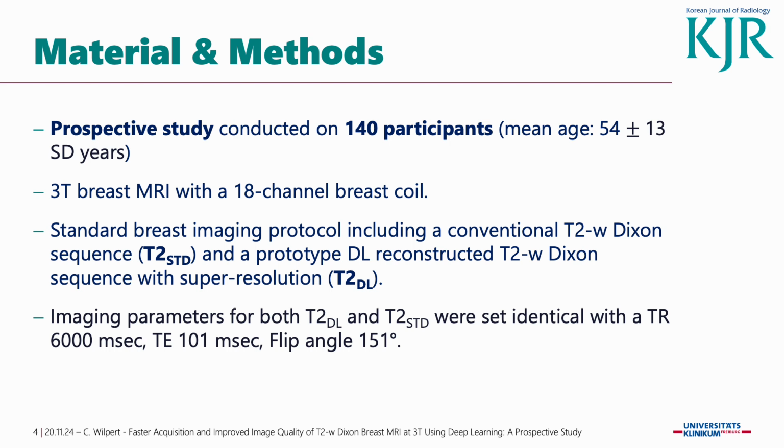It's a prospective study conducted on 140 participants with a mean age of 54 years, performed on a 3T breast MRI with an 18-channel breast coil. We implemented the conventional T2-weighted Dixon sequence and a prototype deep learning reconstruction sequence with super resolution in a standard breast MRI protocol with contrast agent, and performed it previous to the contrast agent injection.